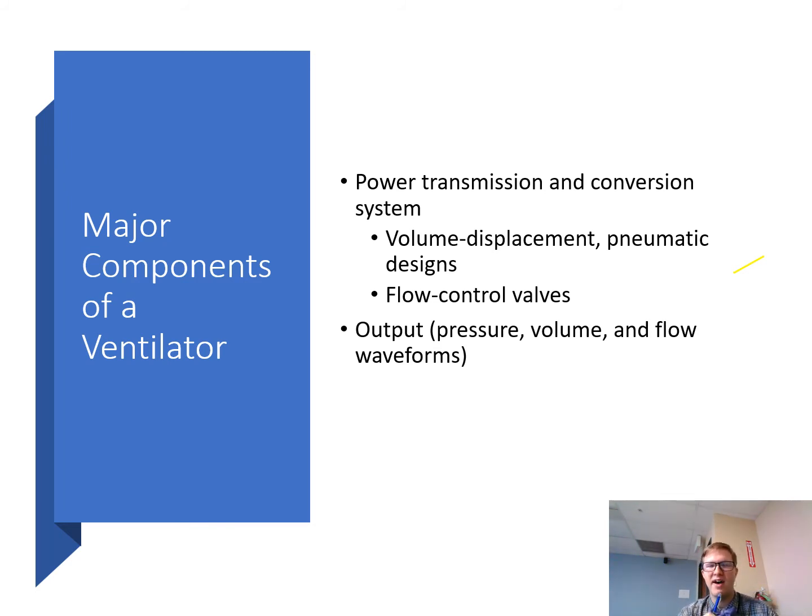A typical valve incorporates a gate or some sort of plunger, a valve seat, and electromagnets. This is why these machines have to be MRI compatible at least. A diaphragm, a spring, electrical contacts. So what happens here: an electrical current flows through the electromagnet and creates a magnetic field.